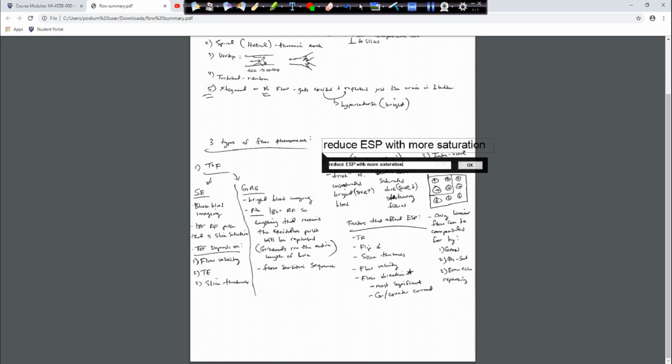And remember, entry slice phenomena means that first slice, that flowing blood is really bright because it's fresh compared to our saturated or beaten down stationary tissues. Remember, fresh blood flowing in has not received any RF pulses compared to all that stationary tissue within our field of view that's already received multiple RF pulses. So fresh means unsaturated, beat down means saturated. So dark stationary tissue, bright flowing blood. So the factors that affect ESP are anything that really affects saturation.